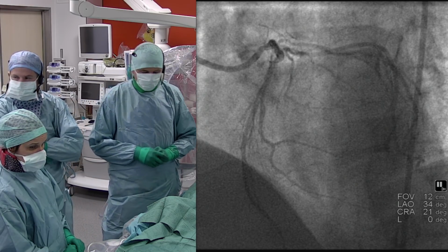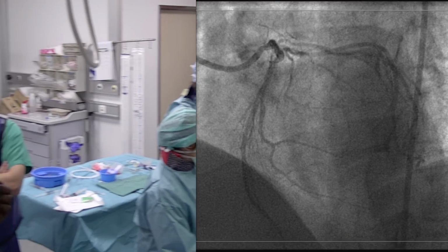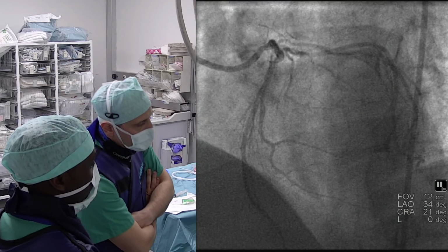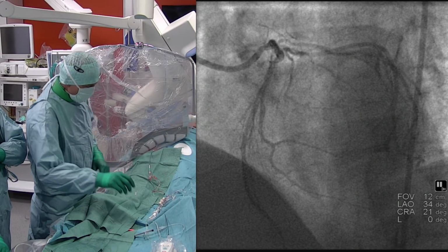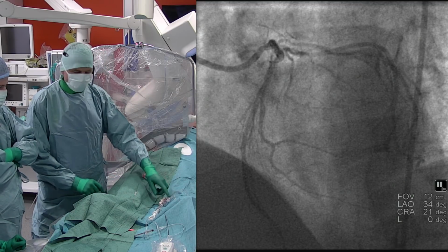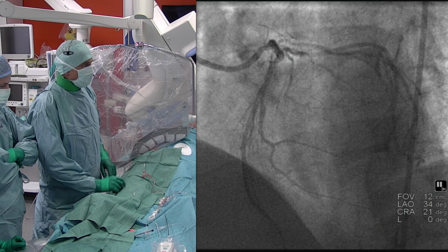Agree? Very good. I think the flow of your decision making in this case is pretty clear. So just to summarize, what you have now at your disposal is a pressure wire. So what you're going to do is a step-by-step functional assessment of the left main LAD lesion. Okay, so we follow you.